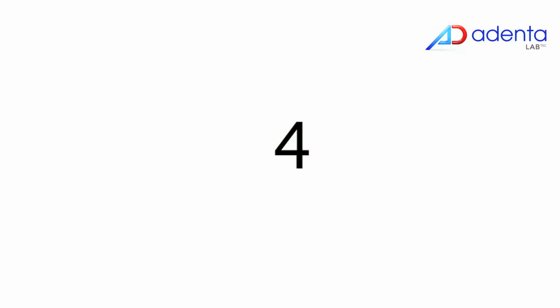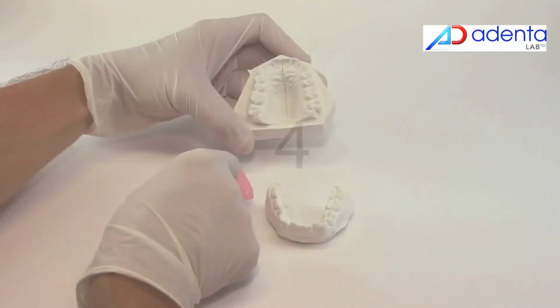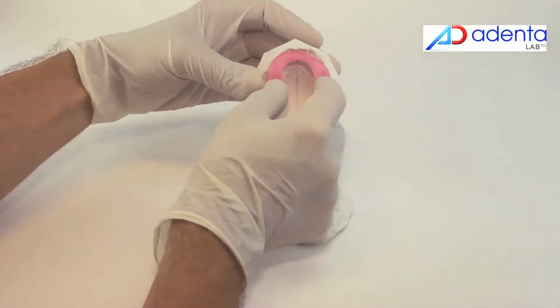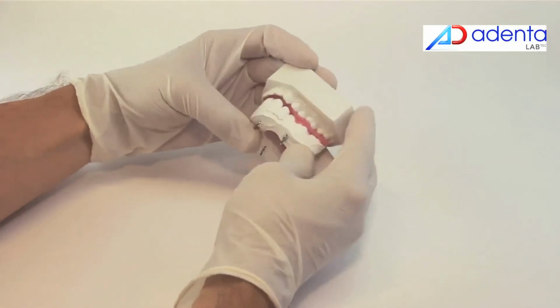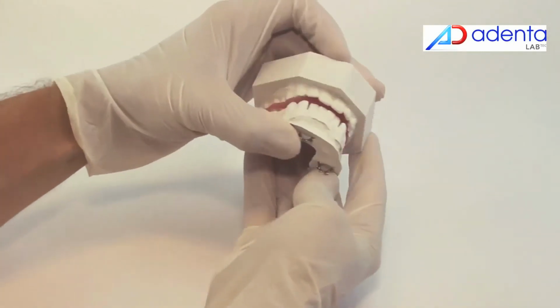Chapter 4: Lower Study Model. Using the wax or silicon bite register, the lower model is positioned in respect to the upper model.